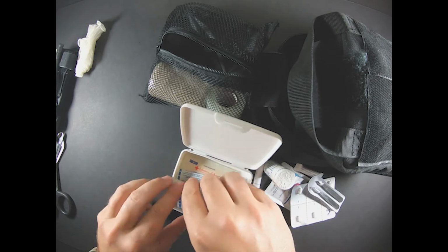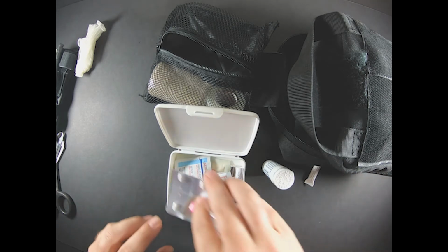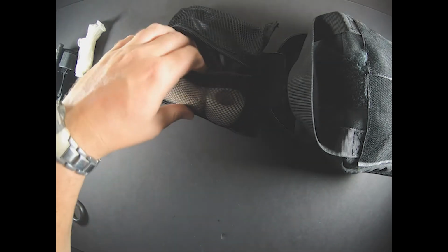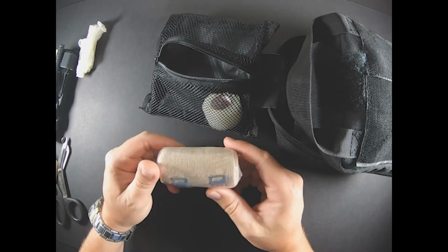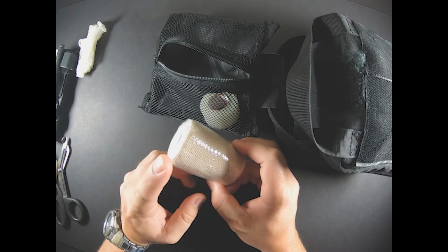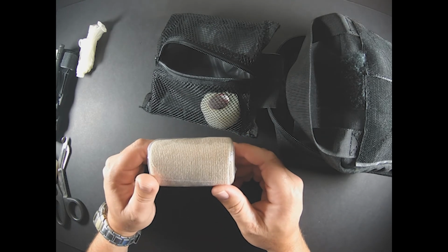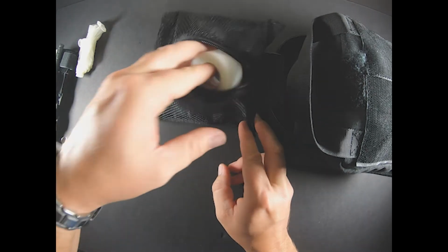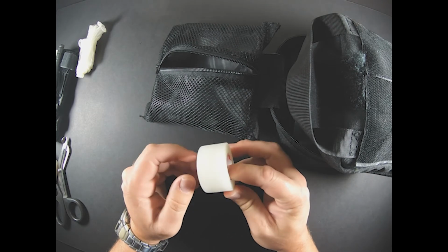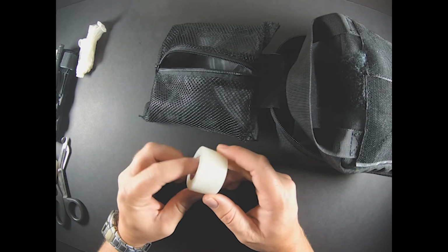So for a little Booboo Kit, if ever needed, it's got quite a bit of little stuff in here, but we'll push all that to the side, repack it here before we put it all back together. Ace bandage, pretty generic. Plenty of things that you could use an ace bandage for. I particularly don't always keep my things in plastic, but the ace bandage does absorb moisture, so I've got that in the plastic. And then again, some medical tape. This is actually some really strong stuff, so if needed, to hold on any bandages, hold on any dressings, things along those lines, you've got that.